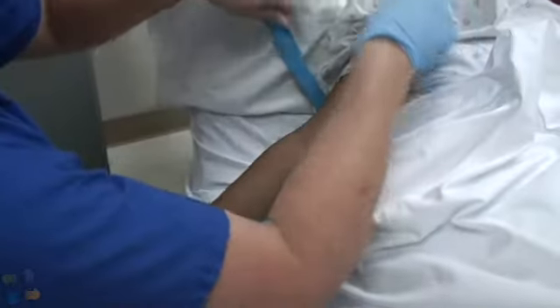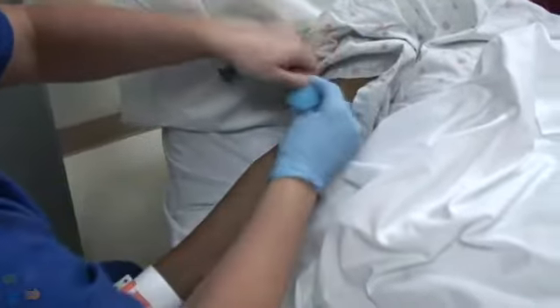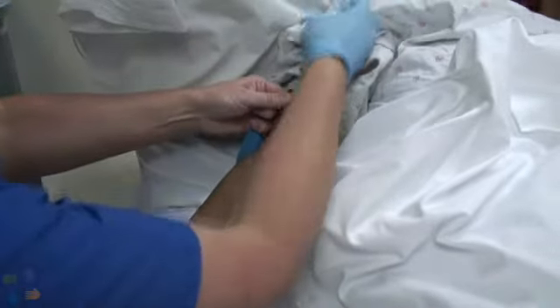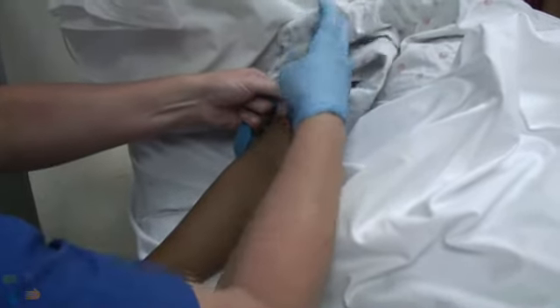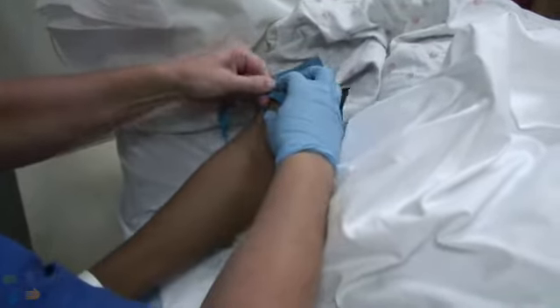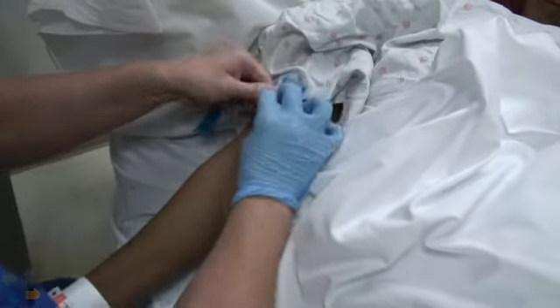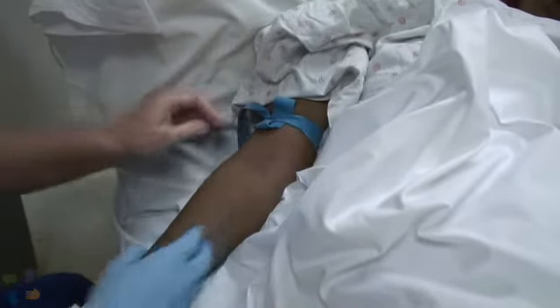Apply a tourniquet to the upper arm by placing it underneath the arm, crossing above the arm, and tucking the overlying end under the middle portion of the opposite end, creating a loop as shown.